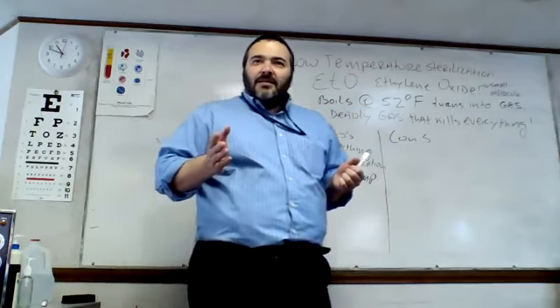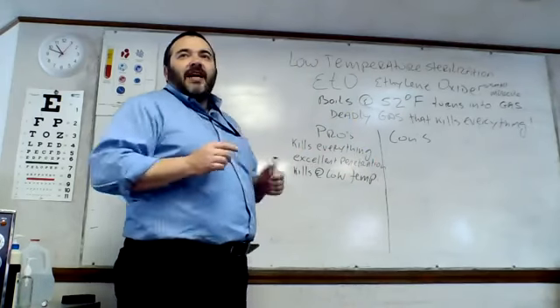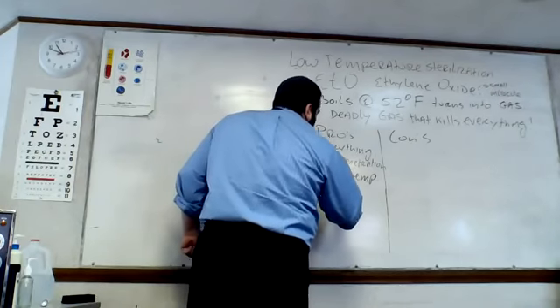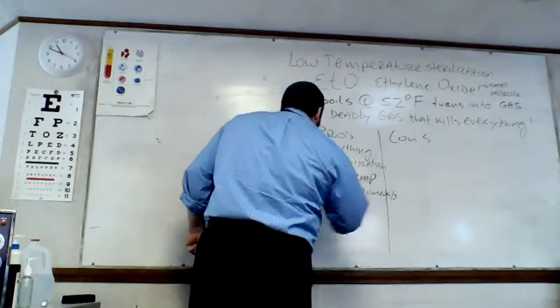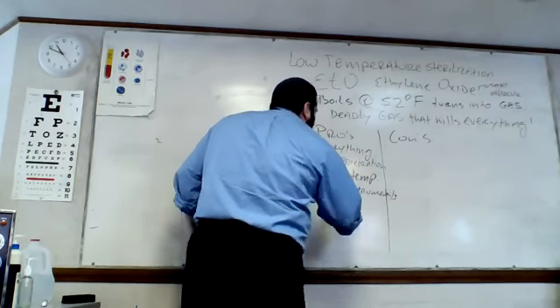Make sense? Now, because it has excellent penetration and it is a small molecule, it is good on instruments with lumens. Okay?